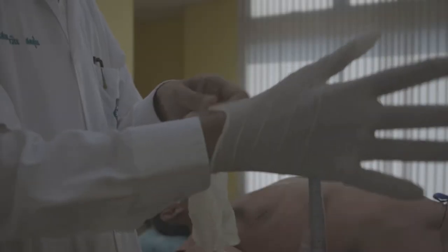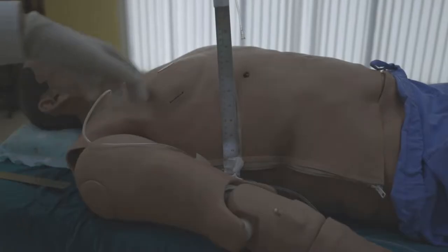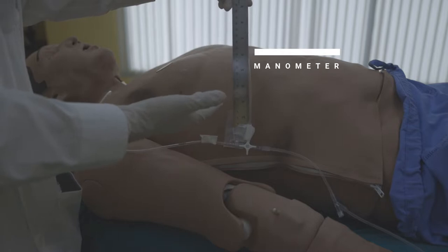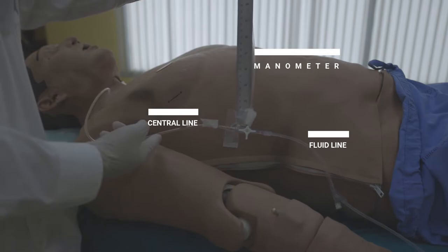Start by wearing a glove, which doesn't require it to be a sterile glove. So here are the tools we need: we have the manometer, which is the ruler attached by the extension tubes, we have the IV fluid line, and we have the central line.